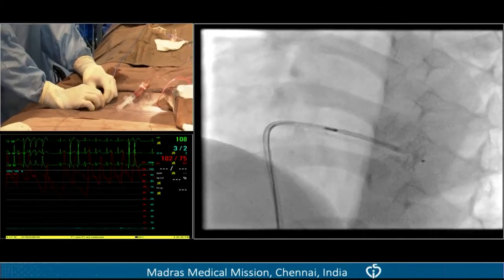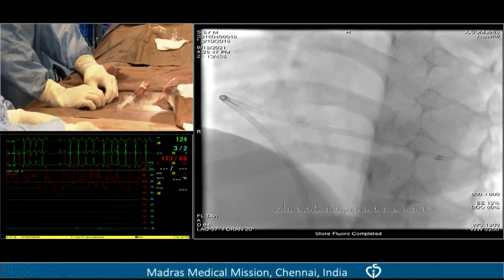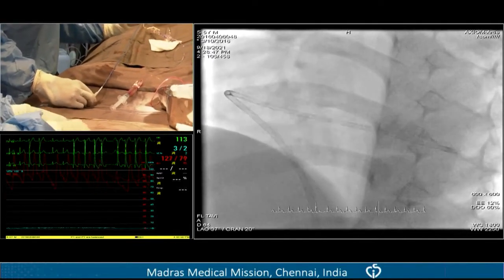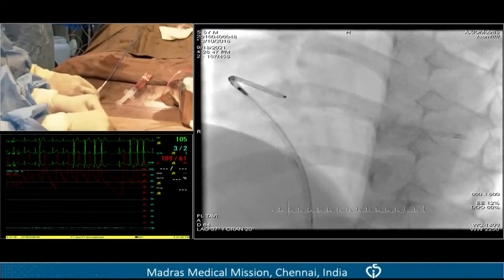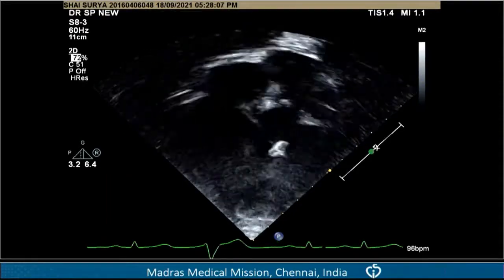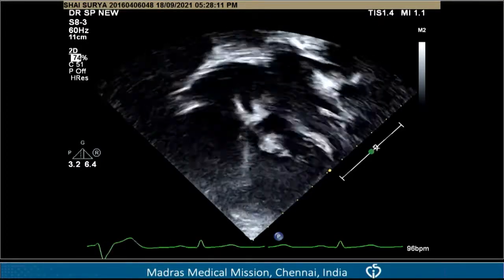Okay, now you show me, Pramod. Okay. So now I have deployed the one disc. Can we see the echo now? Yeah, echo big, echo big, echo big. Very nice. Okay, now I want to release the second disc also. Pramod, hands out.